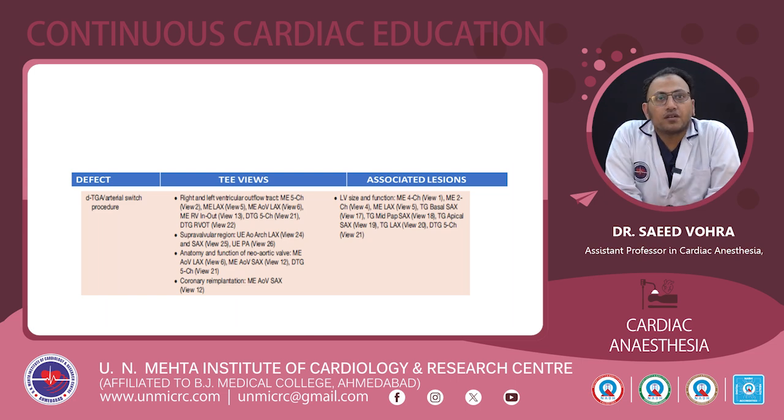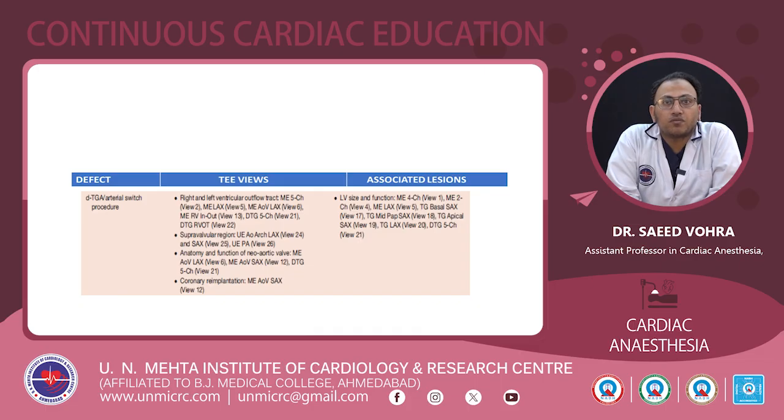For TGA patients operated for arterial switch, the views to be used for the right and left ventricular outflow tract are the mid-esophageal five-chamber, long axis, aortic valve long axis view, RV inflow view, and deep transgastric five-chamber view. For supravalvular regions, the upper esophageal aortic arch long axis view and short axis view and upper esophageal PA view will be helpful. For anatomy and function of the neo-aortic valve, the mid-esophageal aortic valve long axis view and short axis view will be useful, along with the deep transgastric five-chamber view. For coronary reimplantation, the mid-esophageal aortic valve short axis view will give you the information.